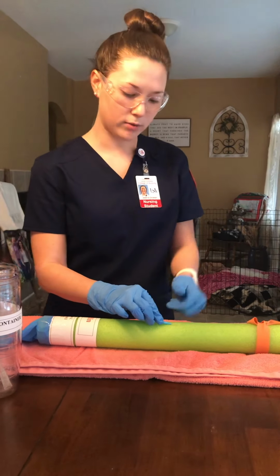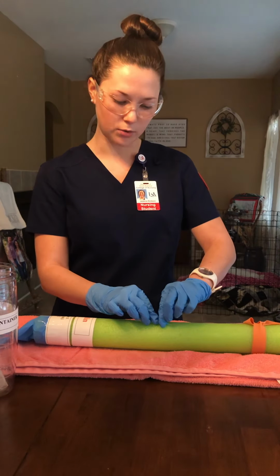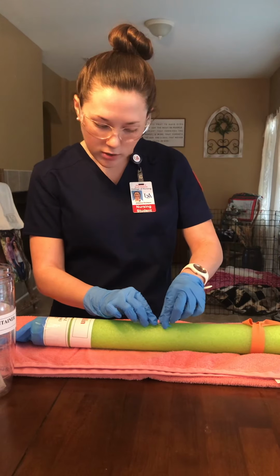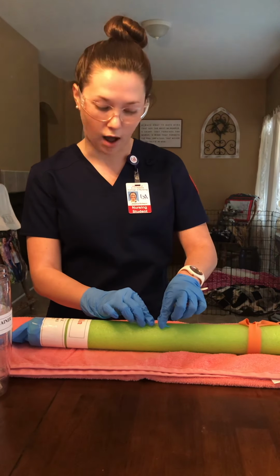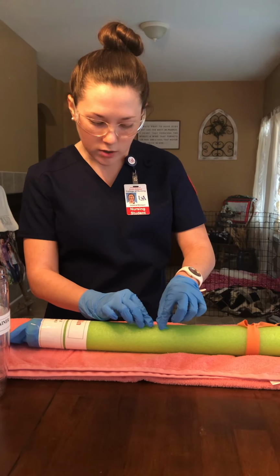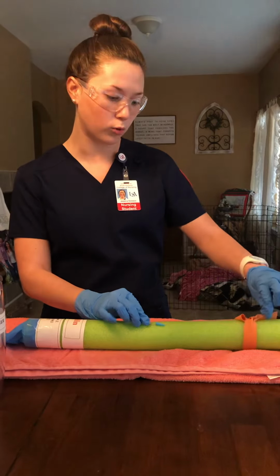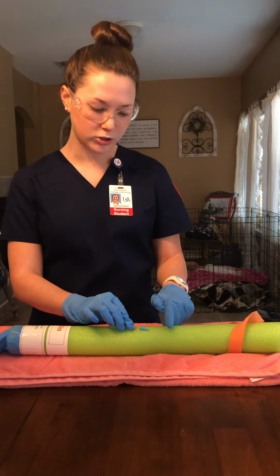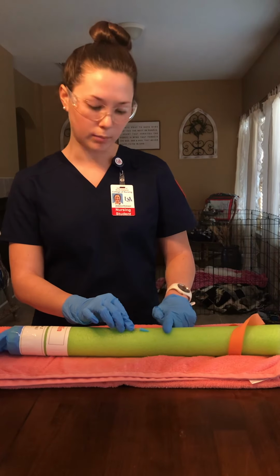Once I do that, I'm going to grab the catheter. I'm going to push it forward all the way to the hub. Once I get it all the way to the hub, I'm going to make sure that I only move that, not the needle. I'm going to pull the tourniquet immediately. Then I'm going to apply pressure 1 1/4 inch above the insertion site.